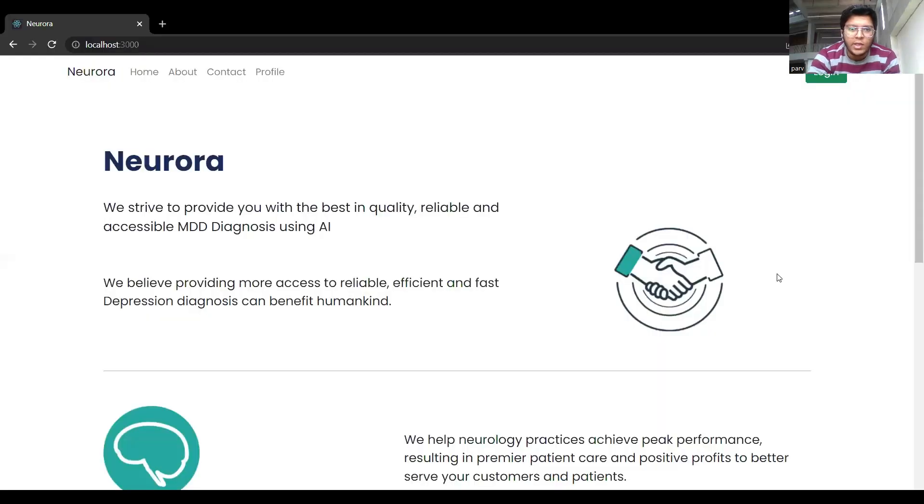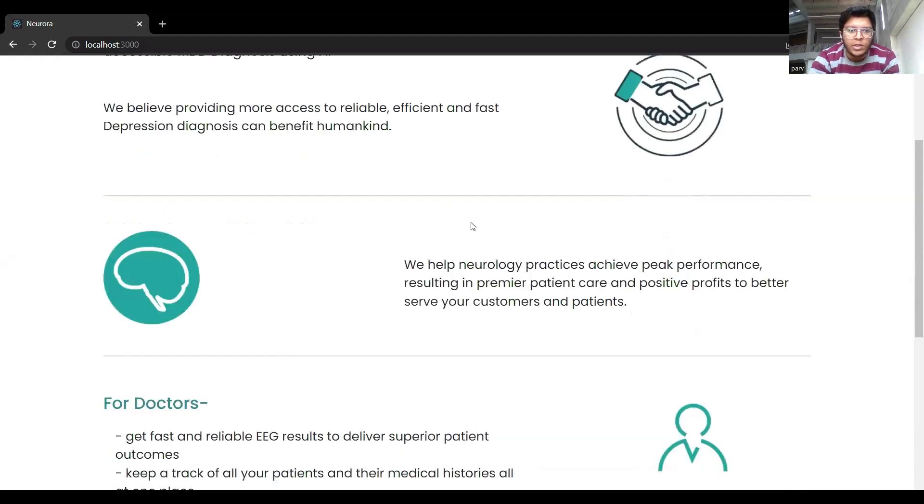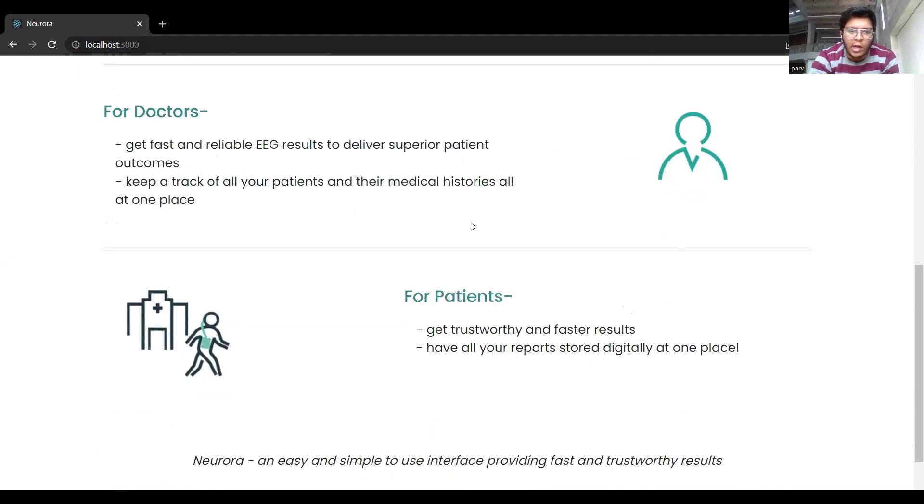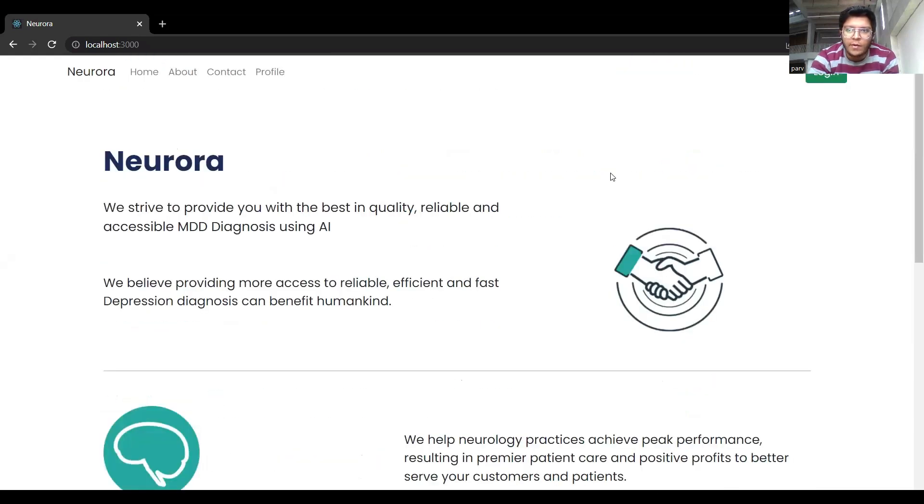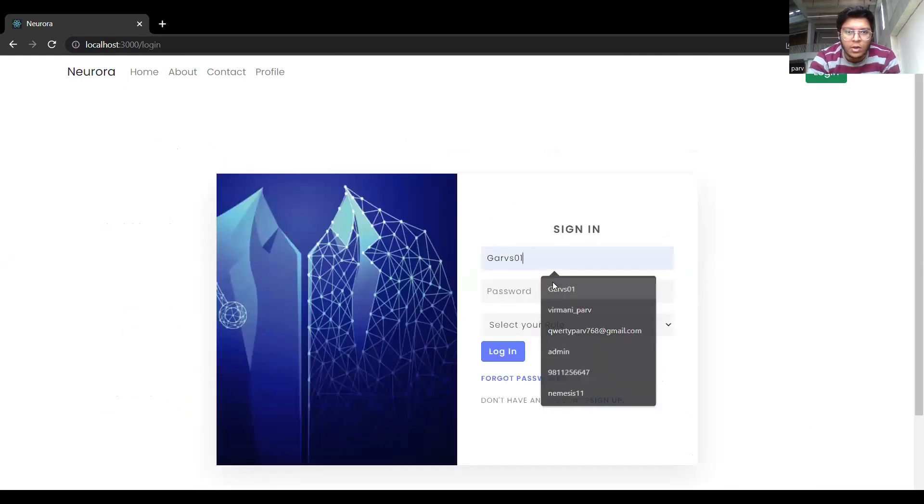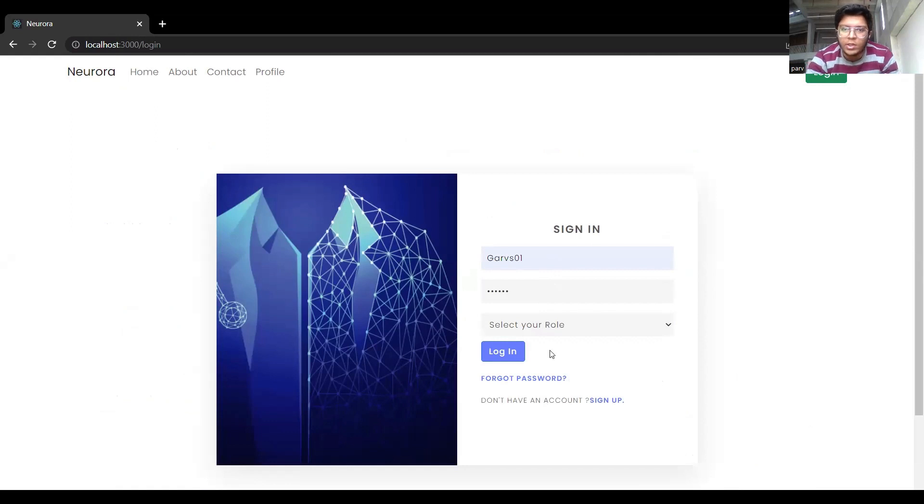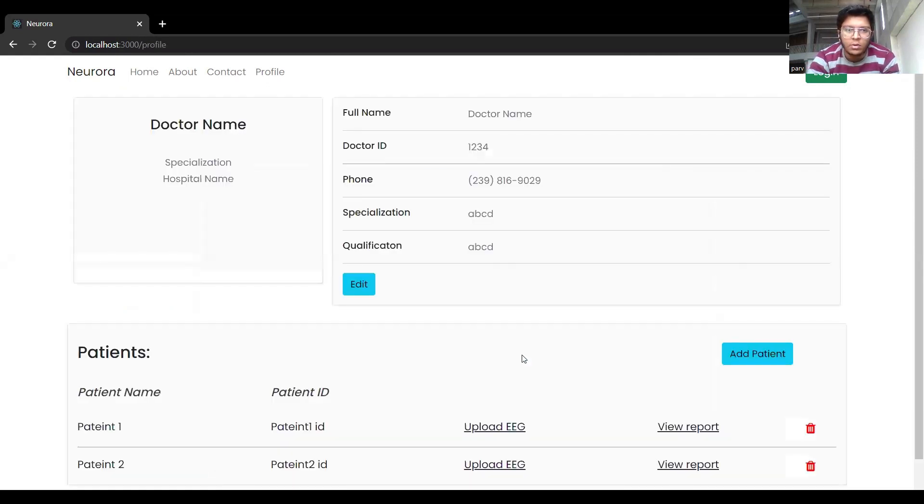So as you can see, here are points to explain what Neurora does to make it easier for users and doctors to understand what we are offering them. So from here, we can go to the login page and enter our credentials as a doctor. You can see doctor, patient, or admin. Anyone can log in and see their details.